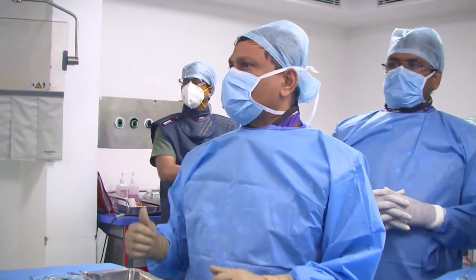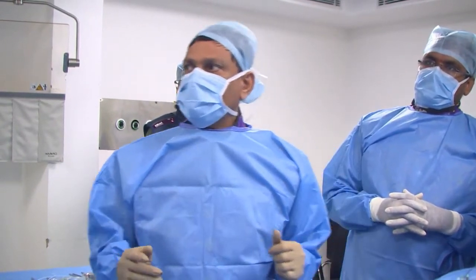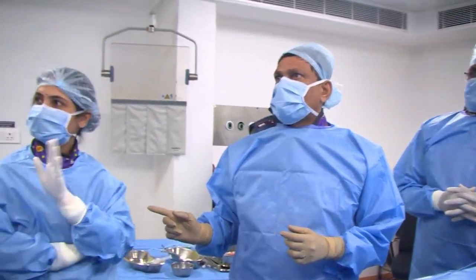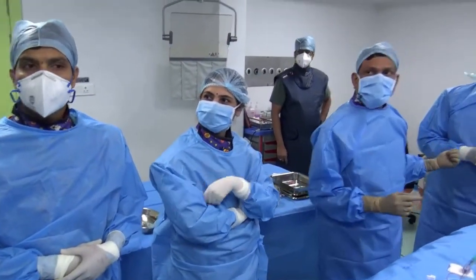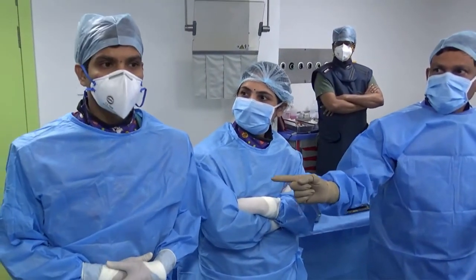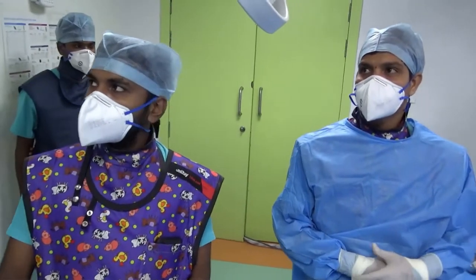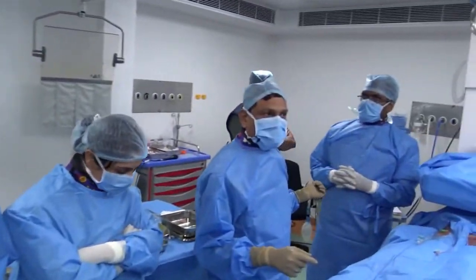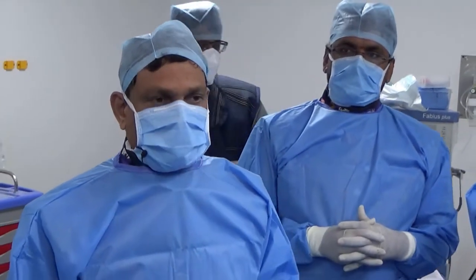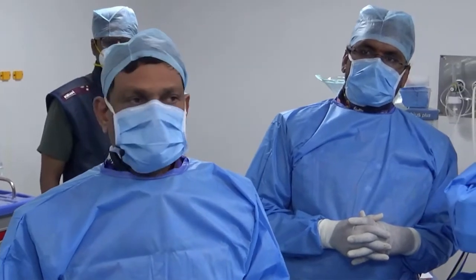So, can I show the audio visual and then Dr. Bhargavi will present the case. Before that, I would like to introduce my team members, Dr. Shweta Bakru, Shweta, Dr. Pavan, and my chief cath lab technician, Pavan, Hemant, Naveen, and Raghu. We have a senior anesthetist, Dr. Patil and Dr. Yogesh here. So, Bhargavi, I request you to present the case details. Yes, sir.